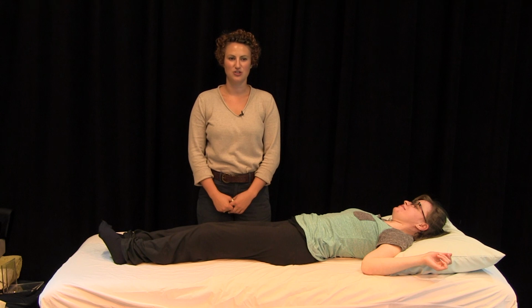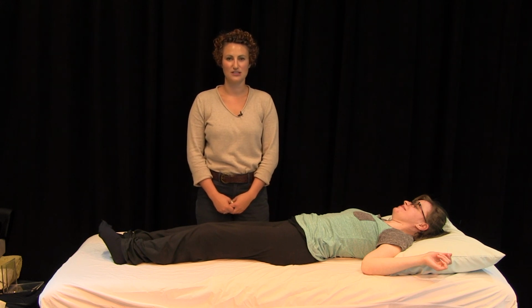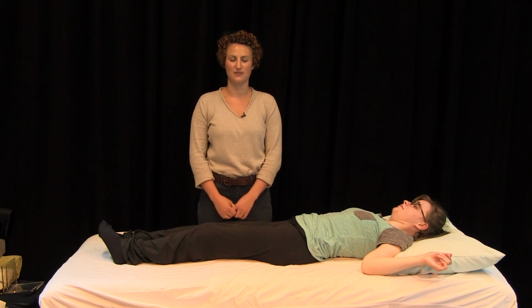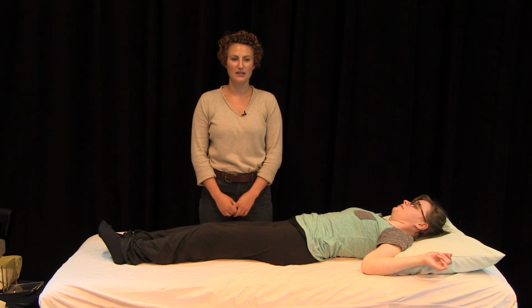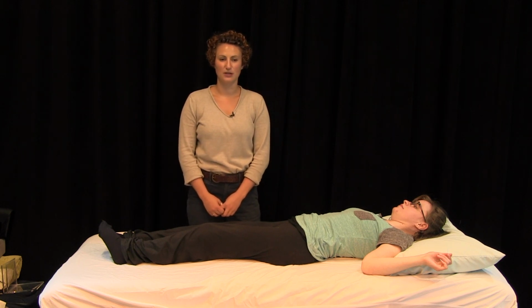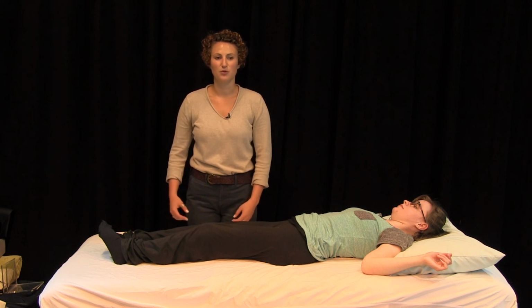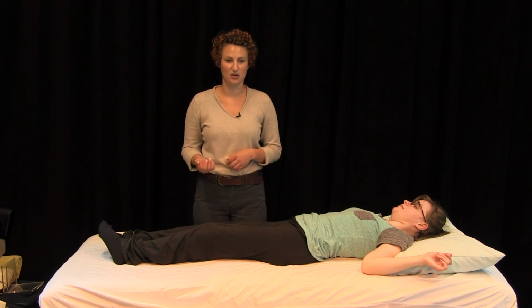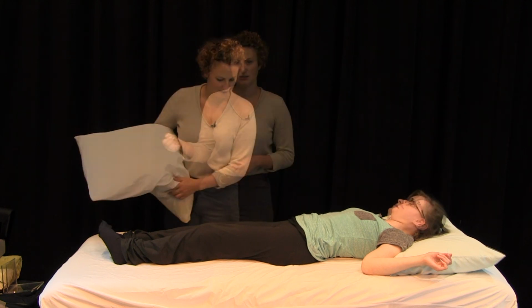Please note that the postural supports used in this video are just options. Many more ideas for postural supports are described in a different video and a PDF resource available on the Posture 24/7 website. To provide comfort, let's begin by supporting under the knees. Most people will immediately experience less tension and more comfort once their knees are resting on a higher surface. Right, ready? Yep.